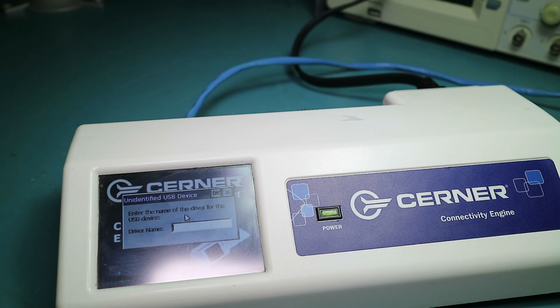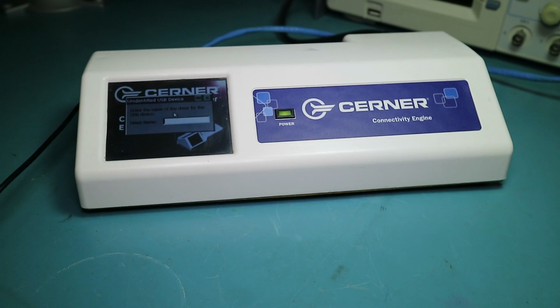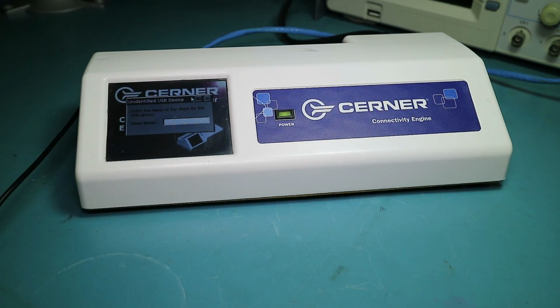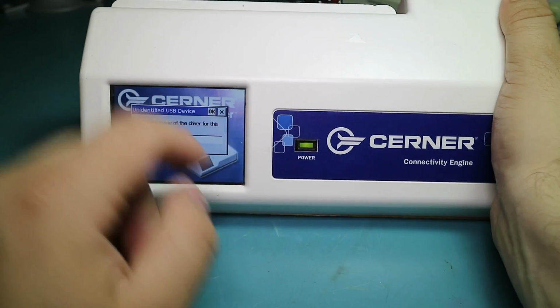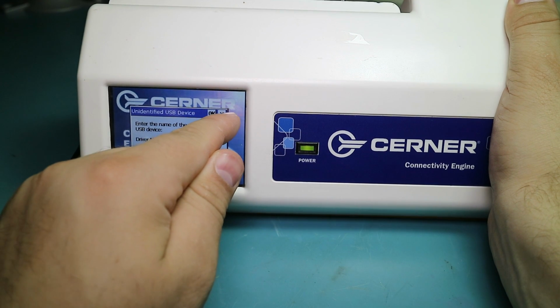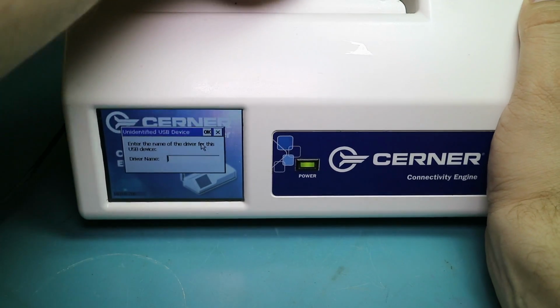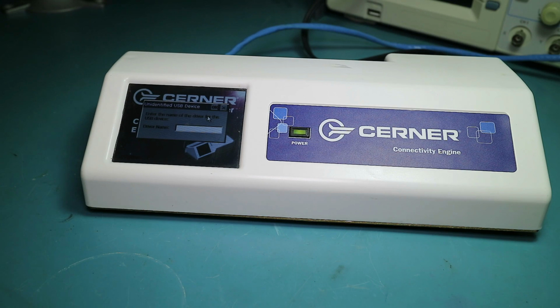Now, it's possible my stuff's just too modern and there aren't many drivers on this, or it's missing software. But if you take a USB keyboard, this does actually register, and it will let you type. At least it used to. I don't know. Maybe it has to be plugged in when it starts up. Not important. Anyway, the USB keyboard worked, and you can just get out of this and it will kind of just keep coming up. You can't really do much. Error installing driver, and then it just kind of pops up again.